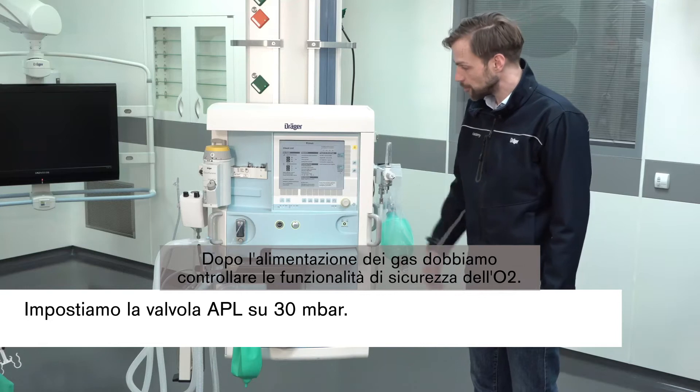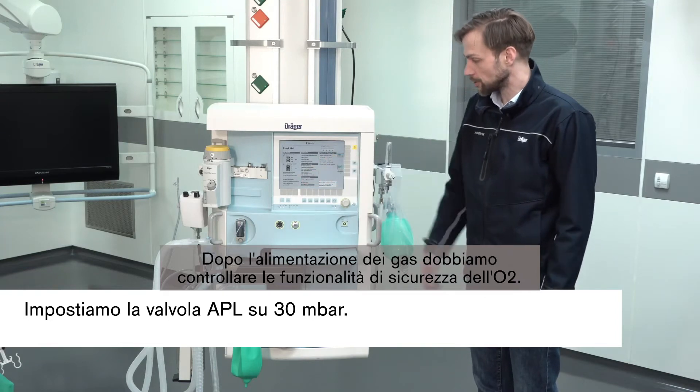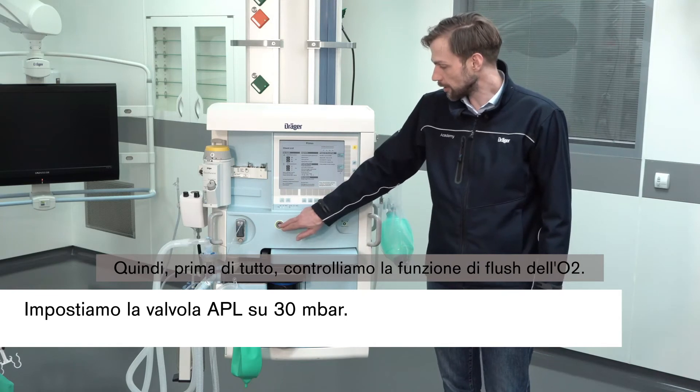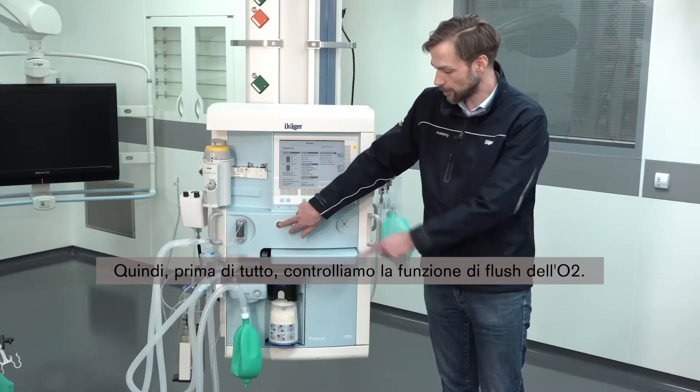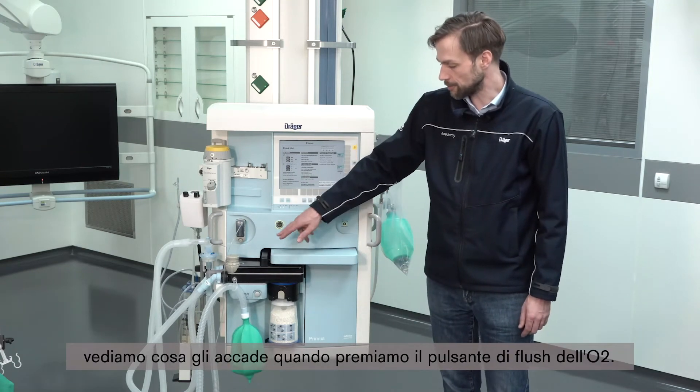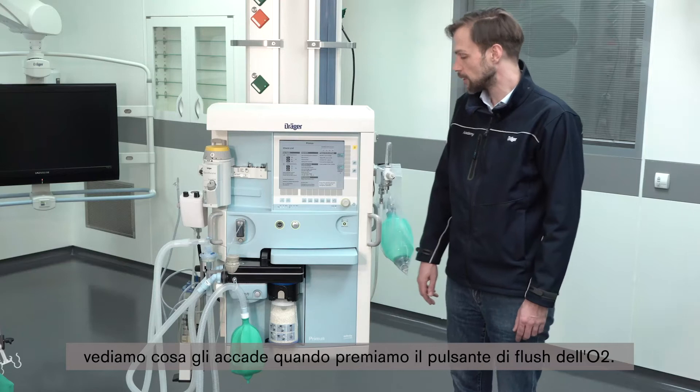After the gas supply we should check the O2 safety functionalities. First, check by the checklist if the O2 flush functionality is working. If we have our eyes on the manual breathing bag, we see the reaction in the bag when we press the O2 flush button.